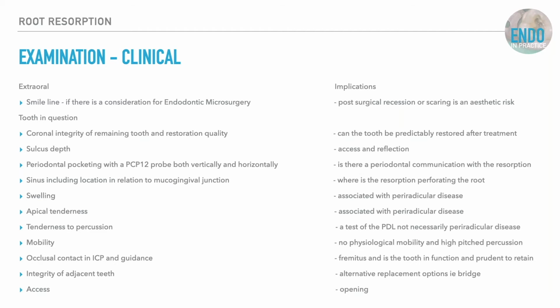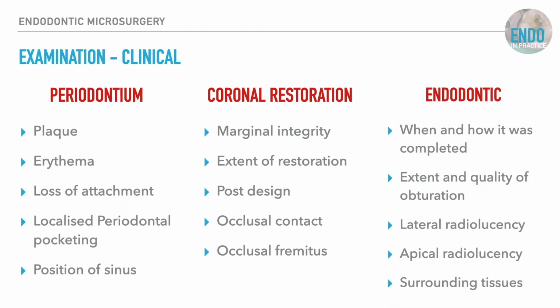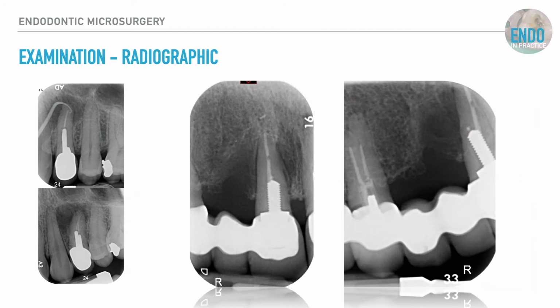You can screenshot this next slide as well. This is just discussing, from an endodontic point of view, a prosthodontic point of view, and a perio point of view, the individual factors that I'm assessing, so that we really know that once we've delivered that treatment, the tooth is amenable and restorable for the patient in the long term. It's not just a single specialty assessment we're doing here, and this is from a restorative point of view, for the patient's benefit. So screenshot that, and I'll talk you through the radiographic examination.